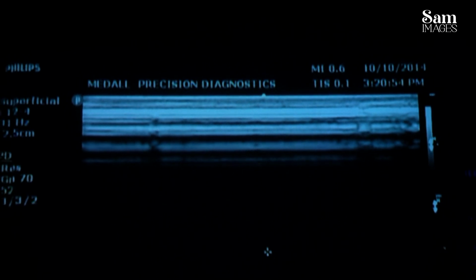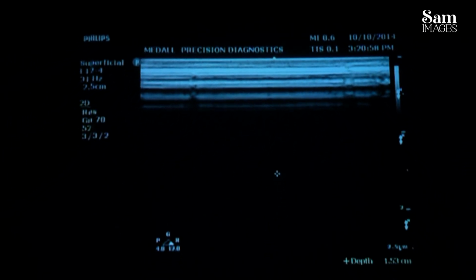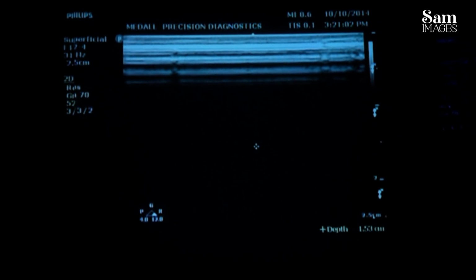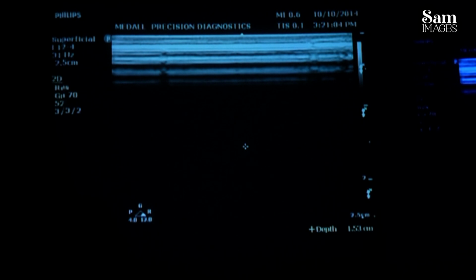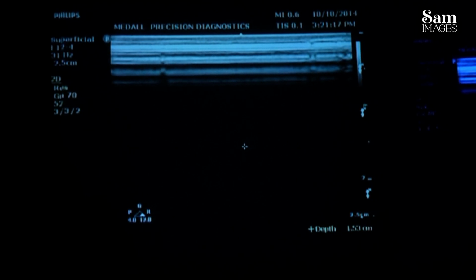Even with this, if you take pan tomography, you can see the bone abnormality. But with open mouth and closed views, you can identify how much the dislocation or subluxation is. When you do a dynamic action, you can find out. But still, when you are going to operate this case and you want a roadmap, then it is better to do an MRI scan. Any doubts in this?